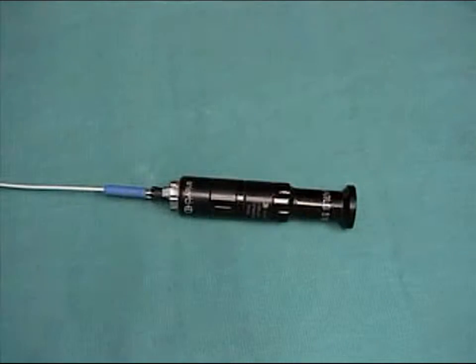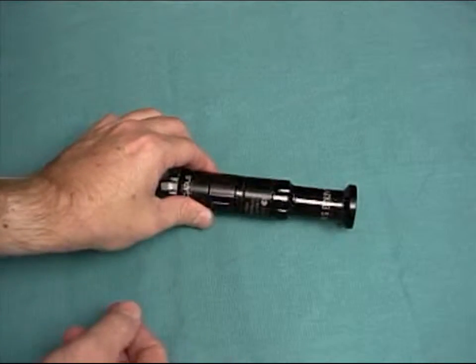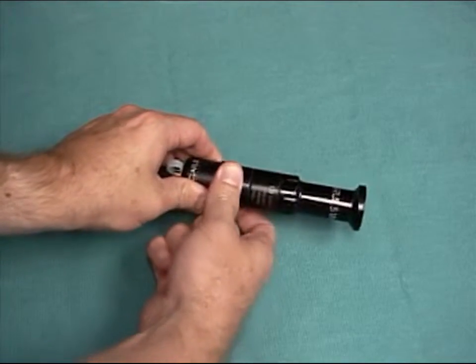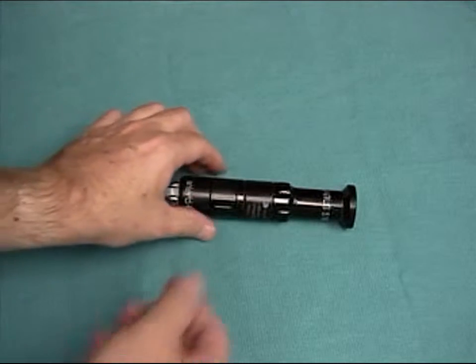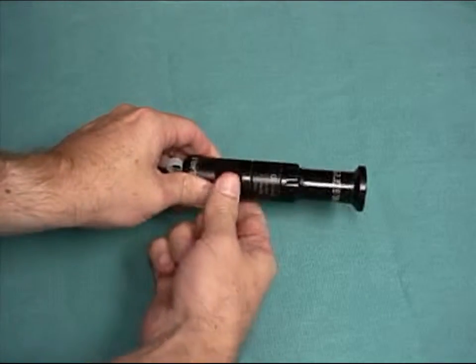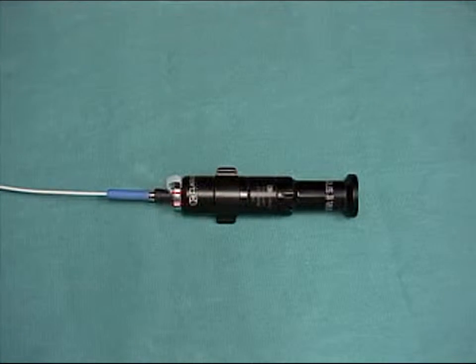Here's how you focus the image. This technique requires only one person and two hands. Place the distal end of the endoscope under a sterile drape. Grasp the endoscope coupler distally with one hand and hold the focusing ring with the other. Turn until the image is smaller, then look at the perimeter of the image and make the edge as sharp as possible. If it's sharp, you'll find that the image is perfectly focused.